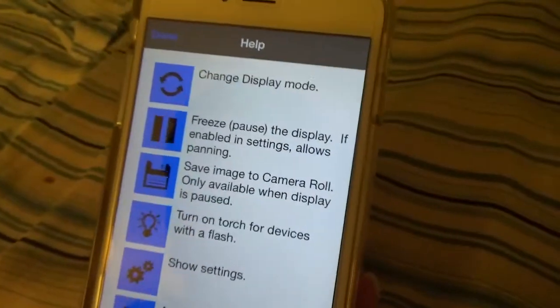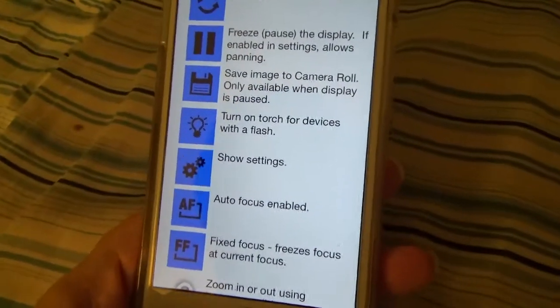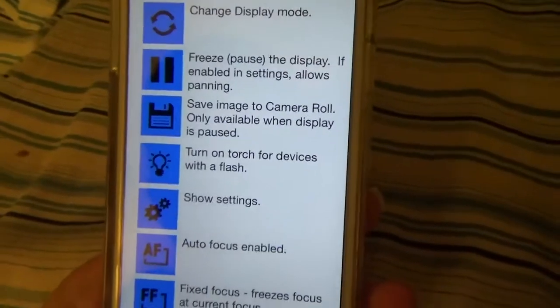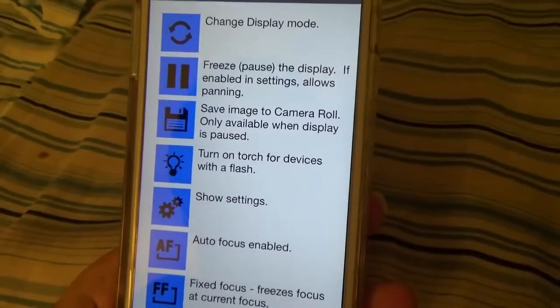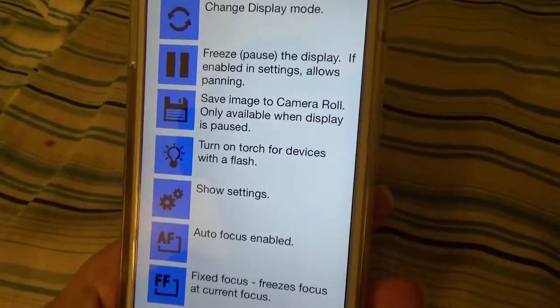And if you take into account the on-contract price of the iPhone, it's considerably cheaper than a standalone video magnifier. And yet, thanks to the software, it's just as fully featured, and even more so because this is a video magnifier that has a phone and a pocket computer built into it, and is far more portable. How can you compete with that?